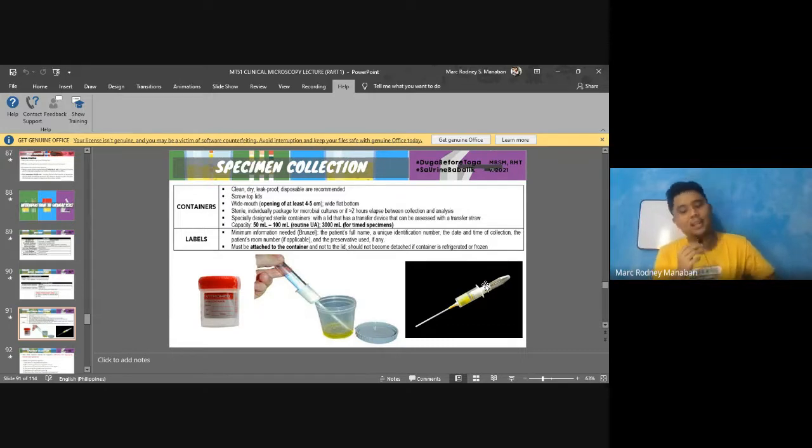Alright. Now, let's say, sige, natay situation. Very common scenario yun here, since mag-hospital assignment na kayo next sem. Let's say you have one specimen lang, urine, actually urine ang pinaka-common. You're the intern assigned in Clinical Microscopy, tapos nakadawat ka ng urine specimen, usara ka buo, and naa siya request for culture and routine urinalysis. So, kinsa man imong unang buhaton?